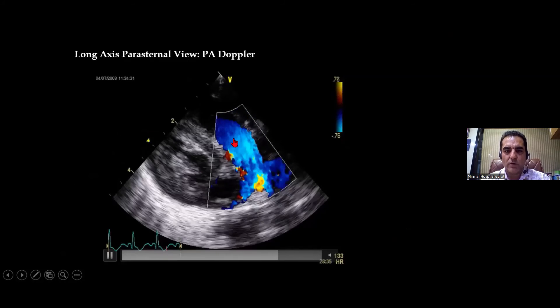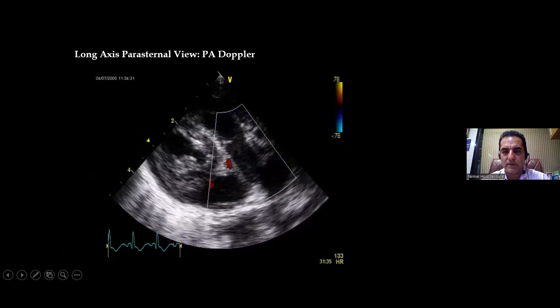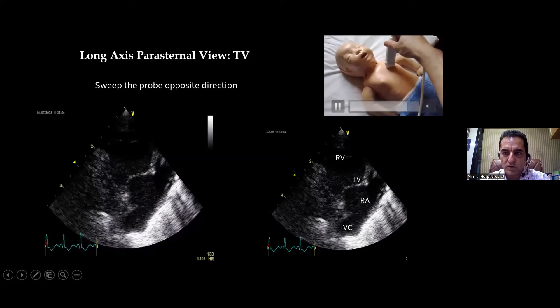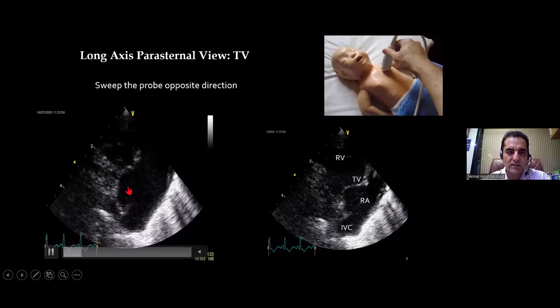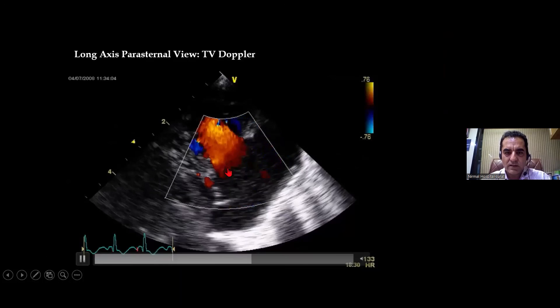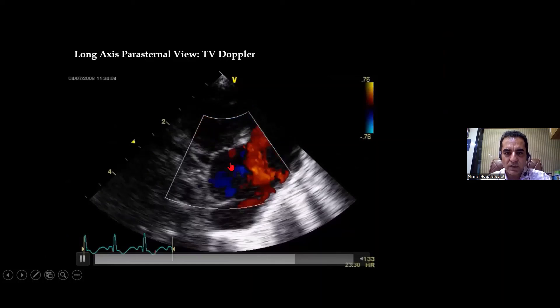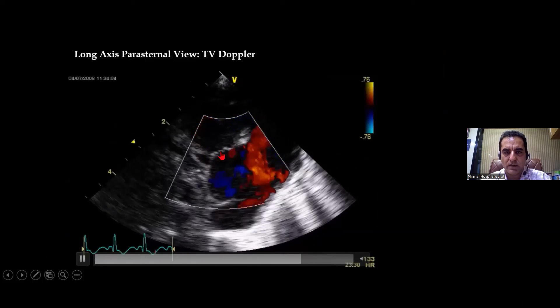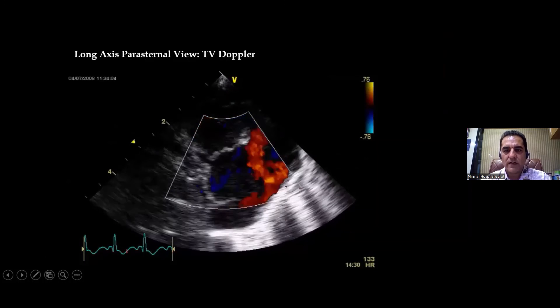Here you are seeing the Dopplers in the pulmonary artery — this is the MPA, RPA, and LPA. Now the probe is being swept downwards towards the foot — this is your tricuspid valve sweep, and you are seeing the tricuspid valve. When color is applied, the flow from RA to RV is towards the probe and is red. There is also a trickle of blue — that is your TR jet, showing blood flow from RV to RA. That is your tricuspid valve.